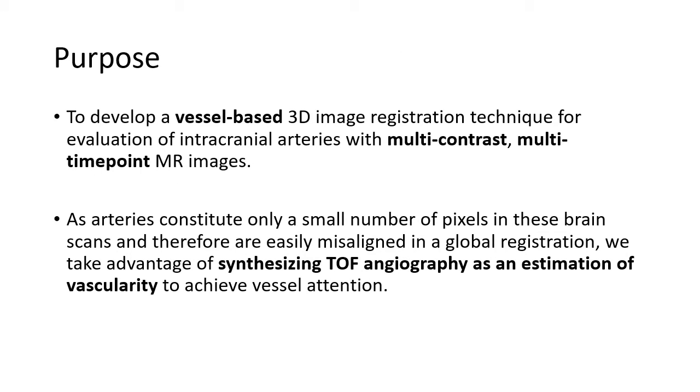So, the purpose of this project is to develop a vessel-based 3D image registration technique for evaluation of intracranial arteries with multi-contrast, multi-timepoint MR images. As arteries only constitute a small number of pixels in these brain scans, and therefore are easily misaligned in a global registration, we take advantage of synthesizing TOF angiography as an estimation of vascularity to achieve vessel attention during registration. This deep learning-based TOF GAN synthesis will help improve the accuracy of multi-contrast, multi-timepoint 3D registration.